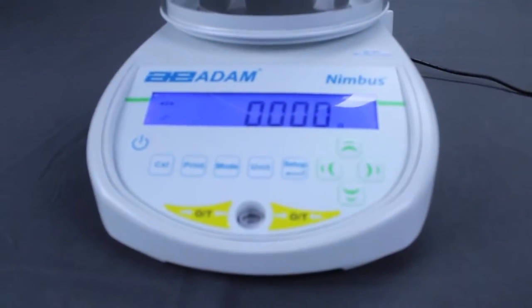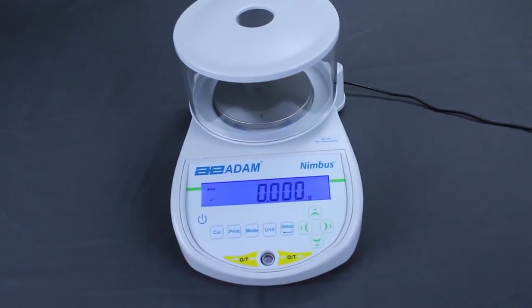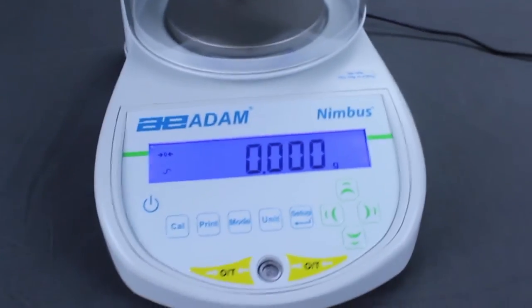Welcome to Adam Equipment's Nimbus Calibration Overview. This video will demonstrate how to calibrate Adam Nimbus balances.